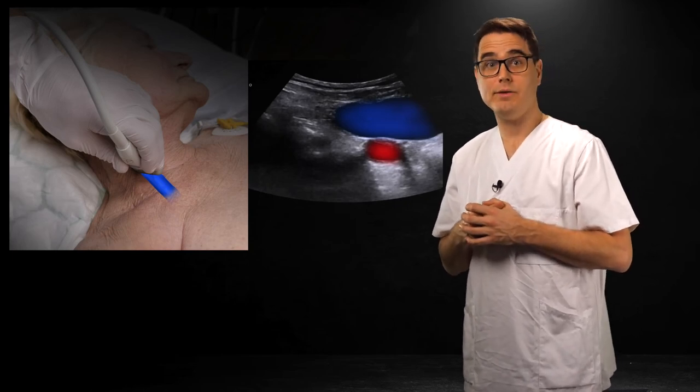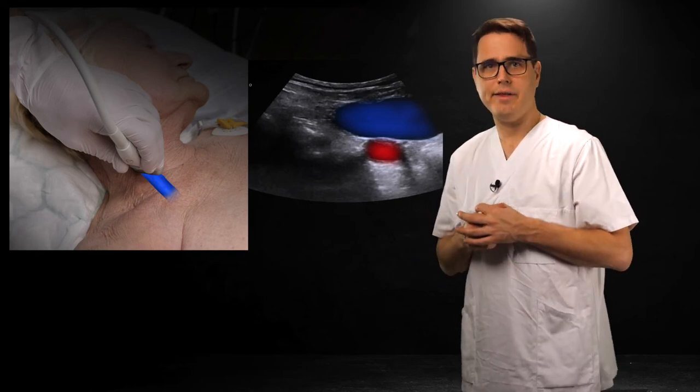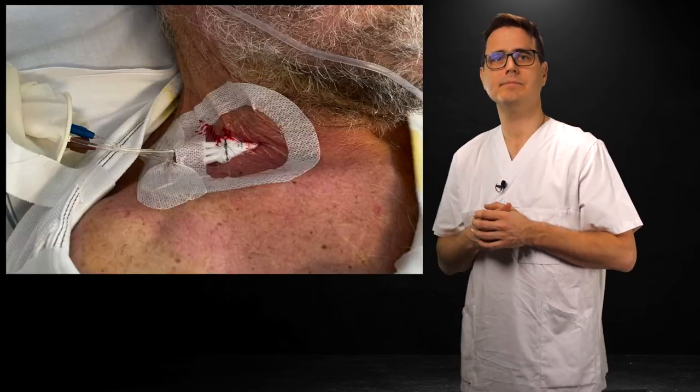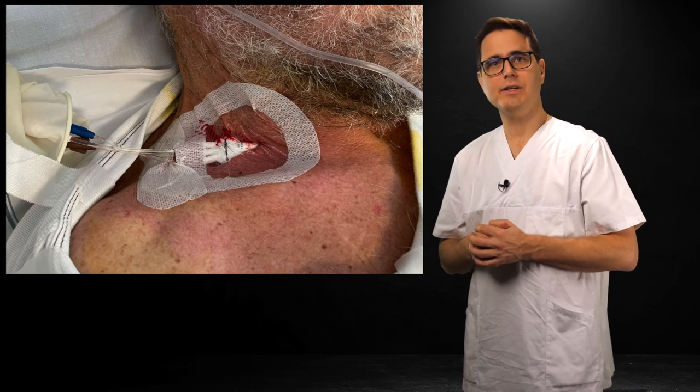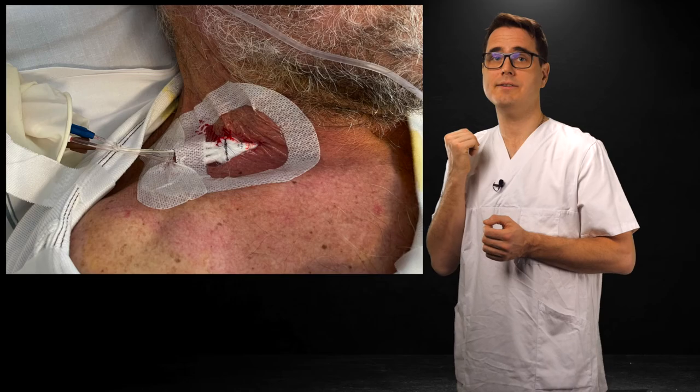It's also very valuable that you can place an IJ line while standing at the patient's side, rather than at the head of the bed. Another advantage is that the line finishes facing away from the patient's face. Remember, in-plane takes practice. There's a learning curve and there will be setbacks. You may have complications. But when you master it, you will be better at placing central lines.